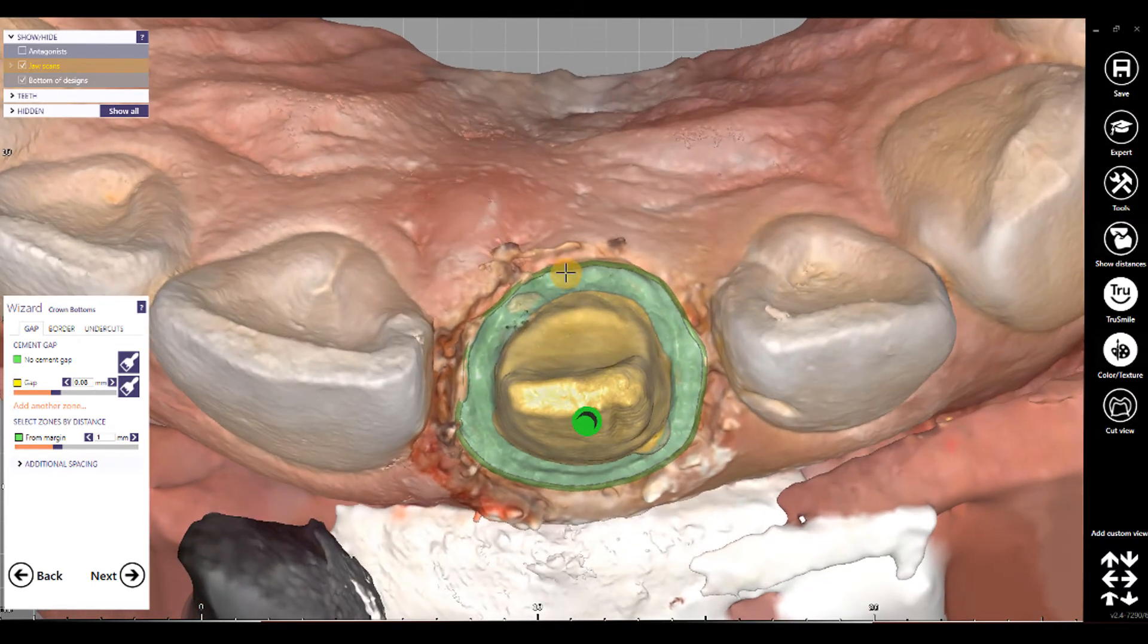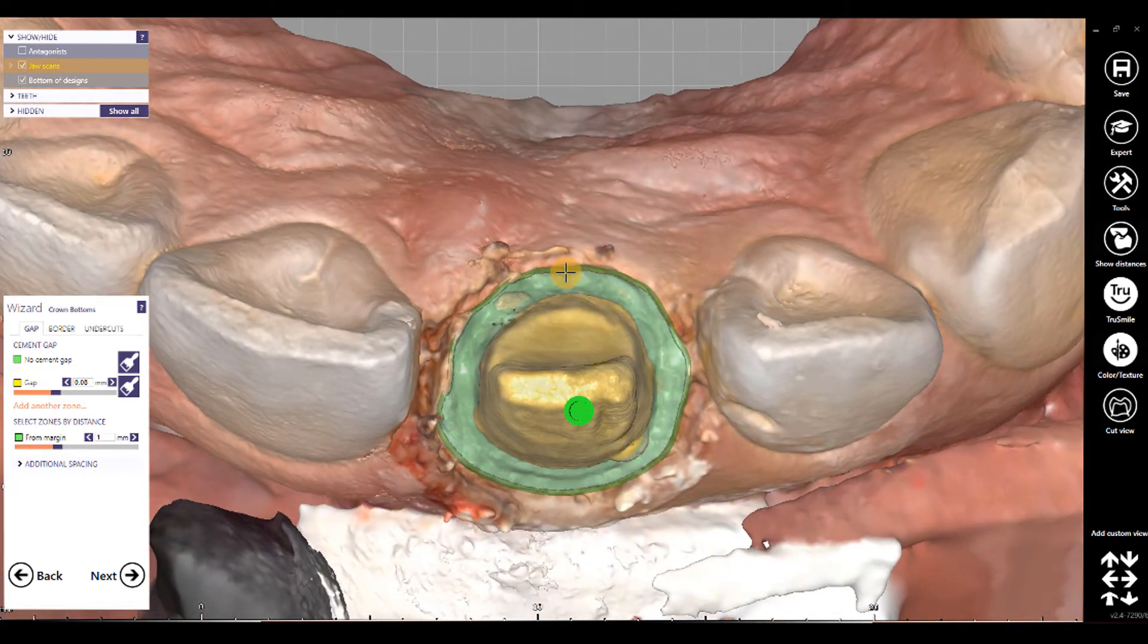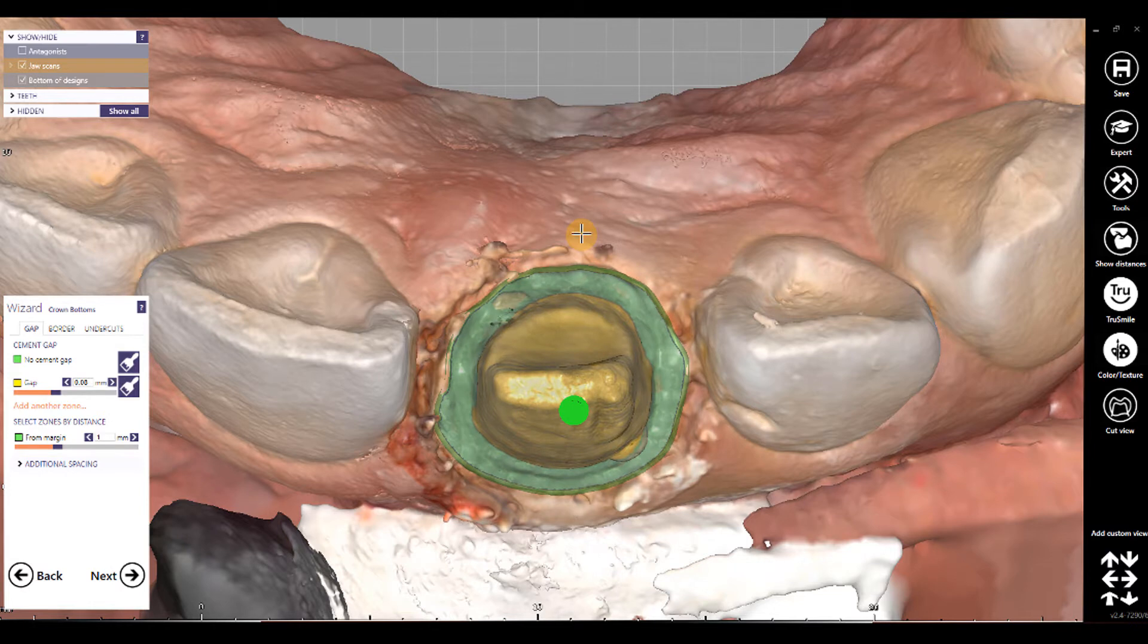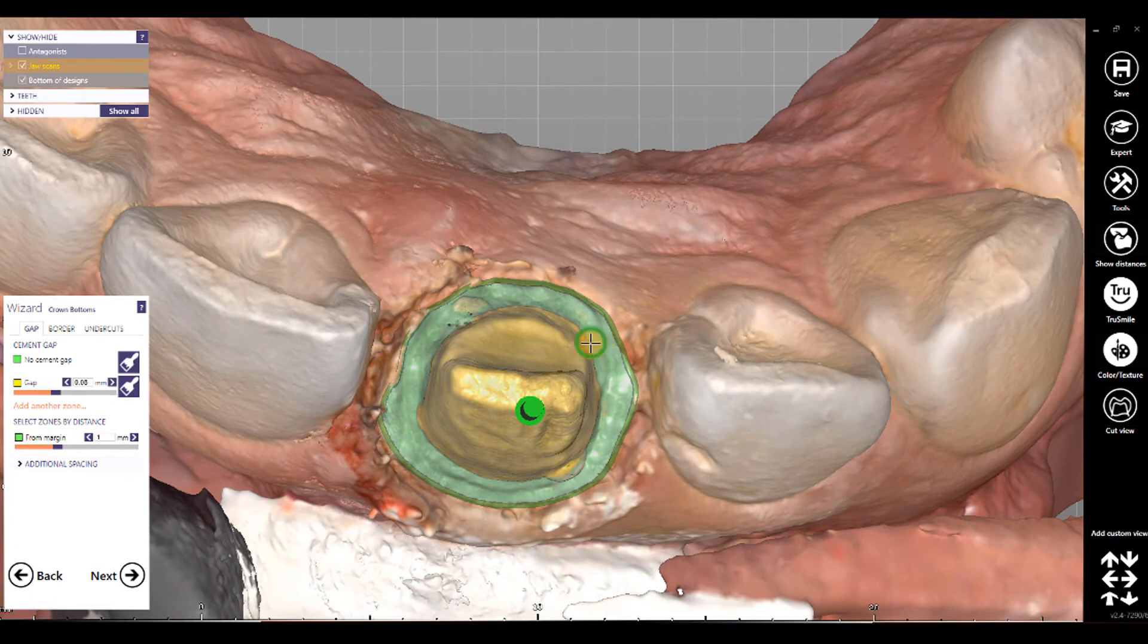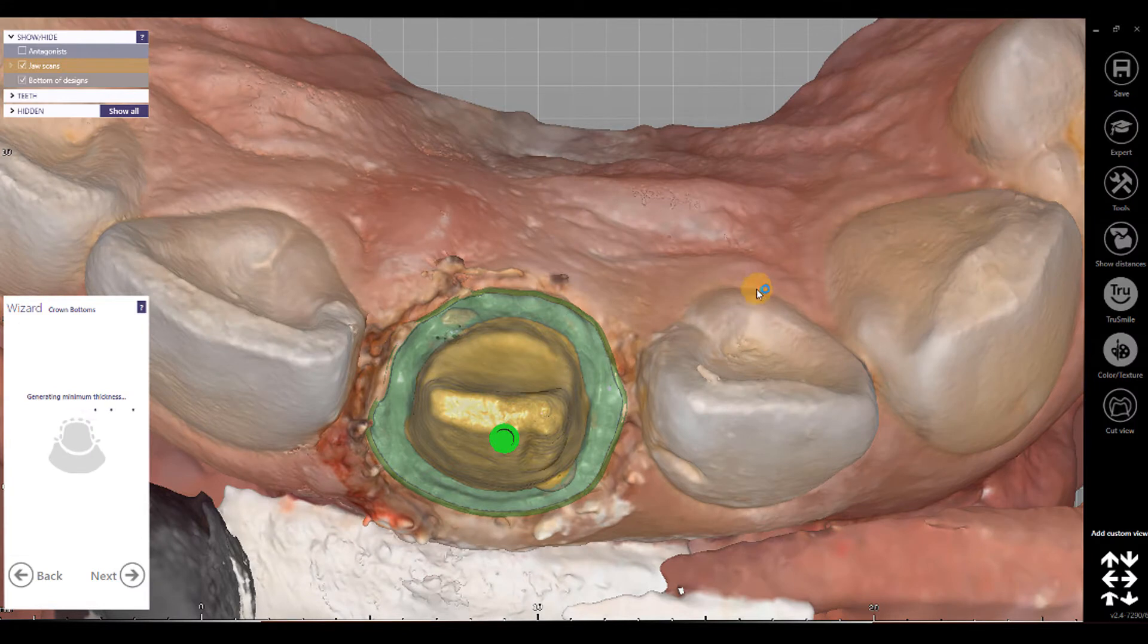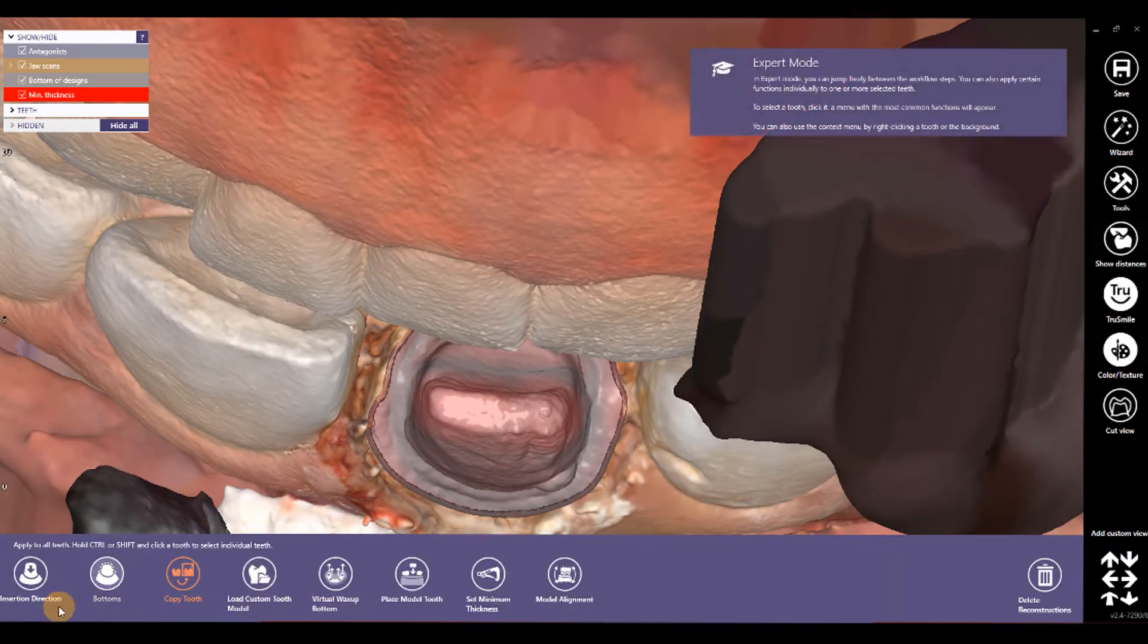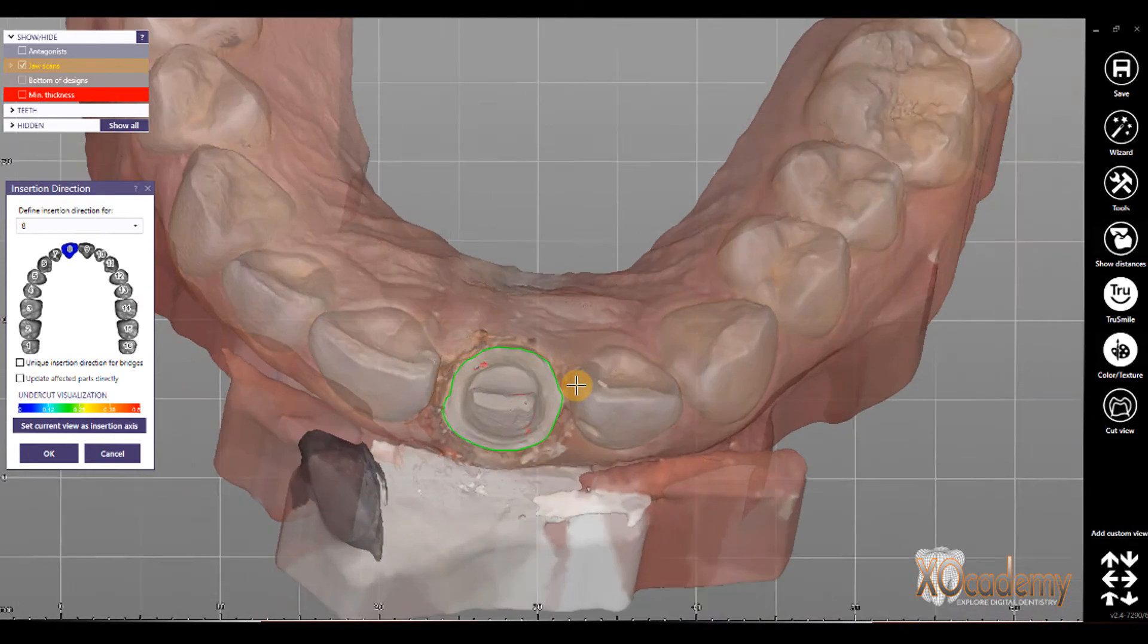You can see ExoCAD defined an insertion axis for us, what it thinks is kind of the best guess, and for me, maybe 75% of the time, it's an okay insertion direction, but that 25% of the time, I want to go back and change the insertion direction. So, the way that you change the insertion direction now is having to go into Expert Mode. Our Expert toolbar here, and clicking Insertion Direction, and that brings up the insertion direction step.